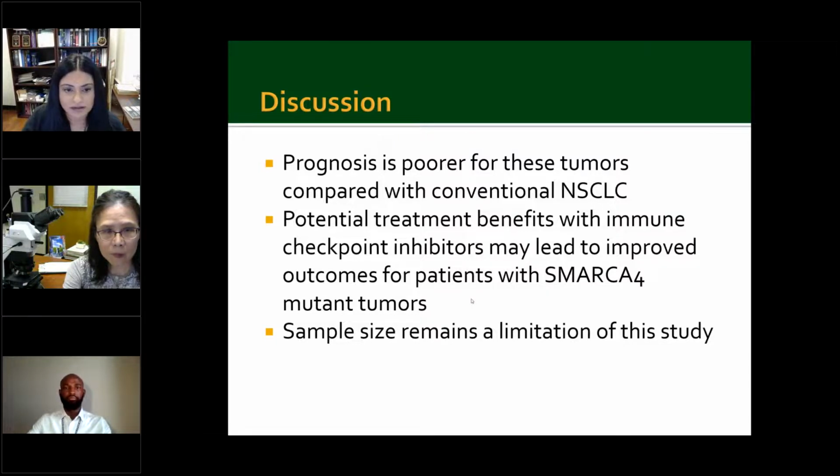So a question for my panelists: what is your top line diagnosis when you have a SMARCA4 or BRG1 deficient non-small cell carcinoma? Is it going in your diagnostic line? Is it going in the comment? How do you word this diagnosis? In my practice now, if I have a case with BRG loss, I would say non-small cell carcinoma with absent BRG, and I just say consistent with thoracic SMARCA4 deficient undifferentiated tumor. That's WHO suggested.